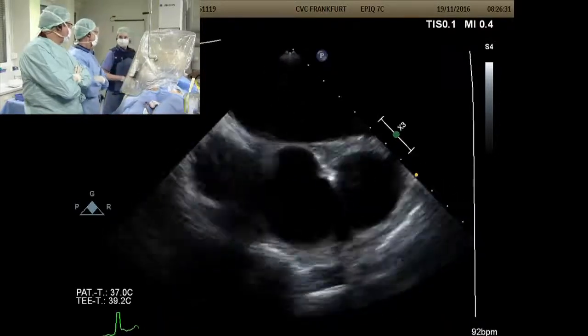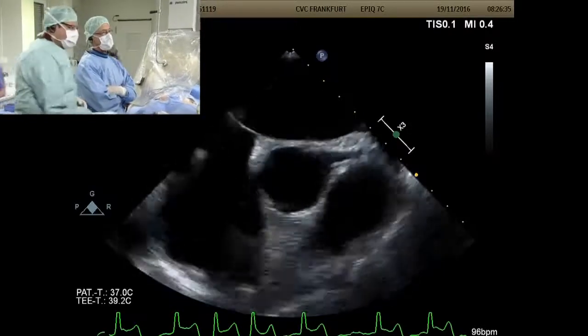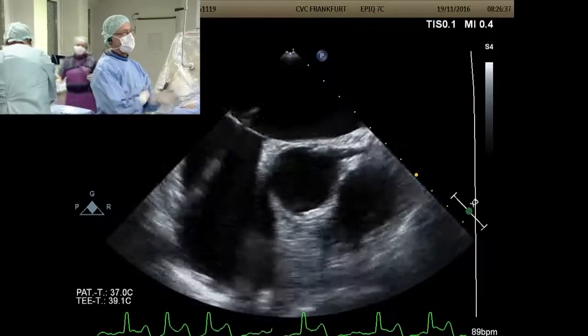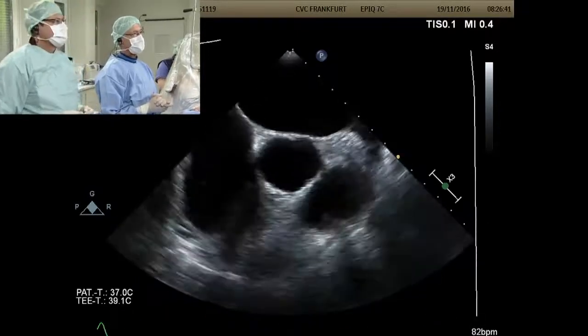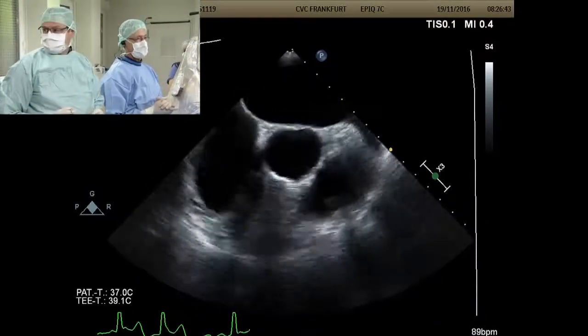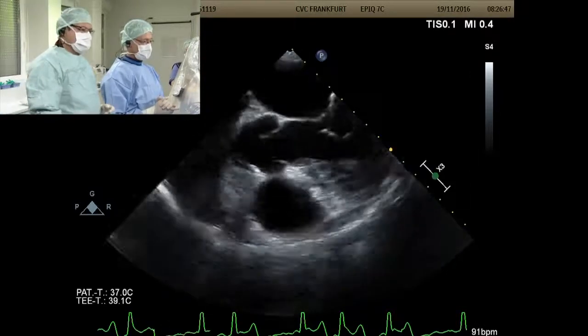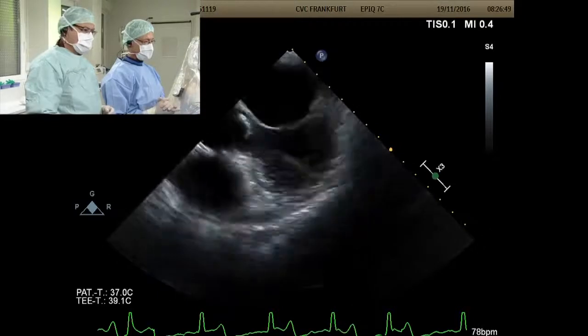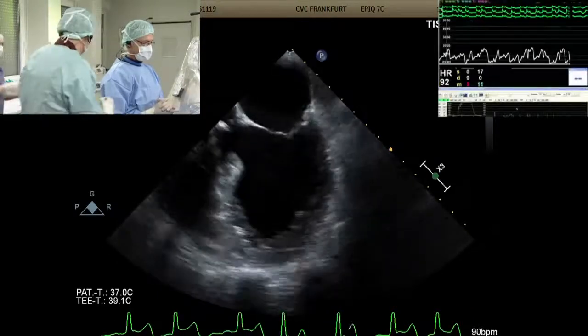Can we check ACT? So it must have been a bit of air, mustn't it? Yeah, but we didn't see this, neither on echo. I de-aired the sheath. So I don't know what I did wrong here, but there's clear ST elevation. LV, full chamber. Could you check LV contraction? Yeah. We're just doing it now, actually. Here we are. That's okay.